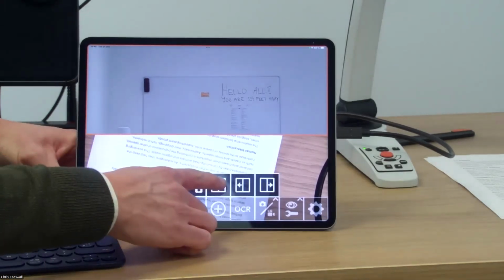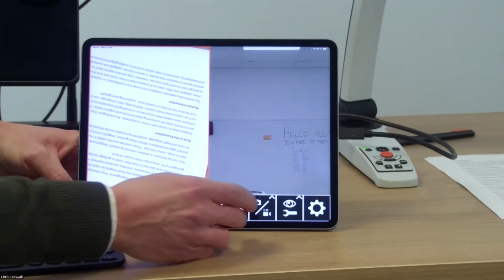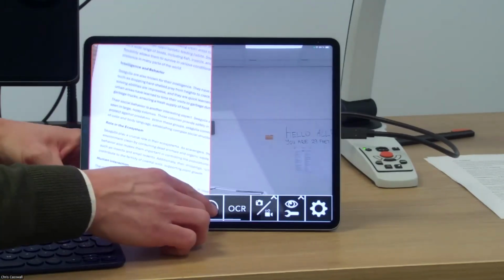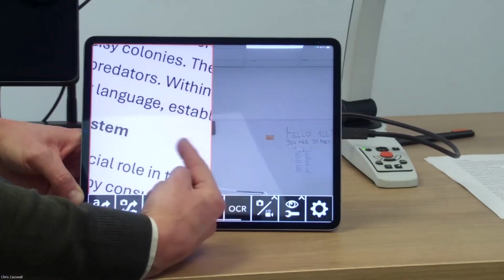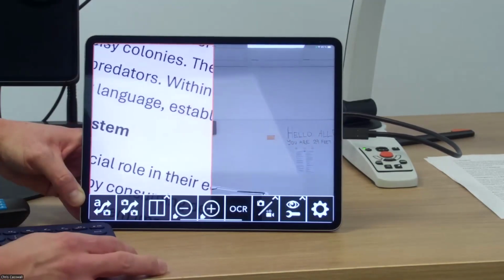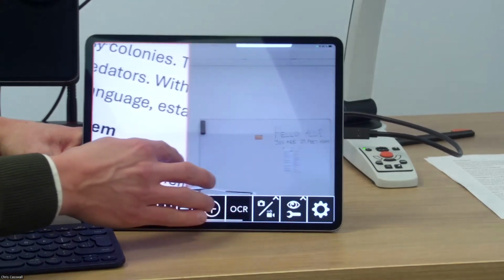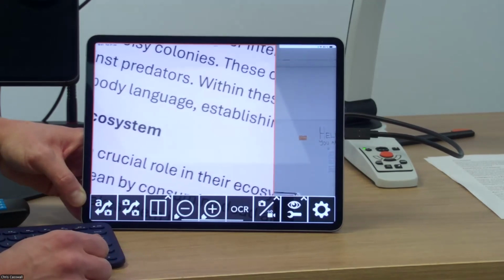So of course, yes, go ahead. Your bottom image is upside down. I did notice that. Okay. I can, of course, rotate that. I just wanted people to know that. Thank you. So now it's no longer. I switched the split to have them side by side instead of top and down while Kimberly was talking. Whatever works for you. I can also adjust the split between the two views to have the distance camera being a little larger or the opposite.